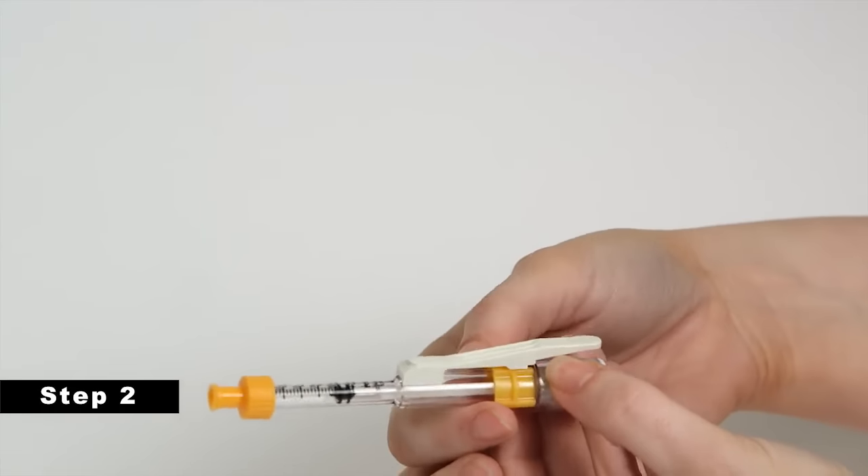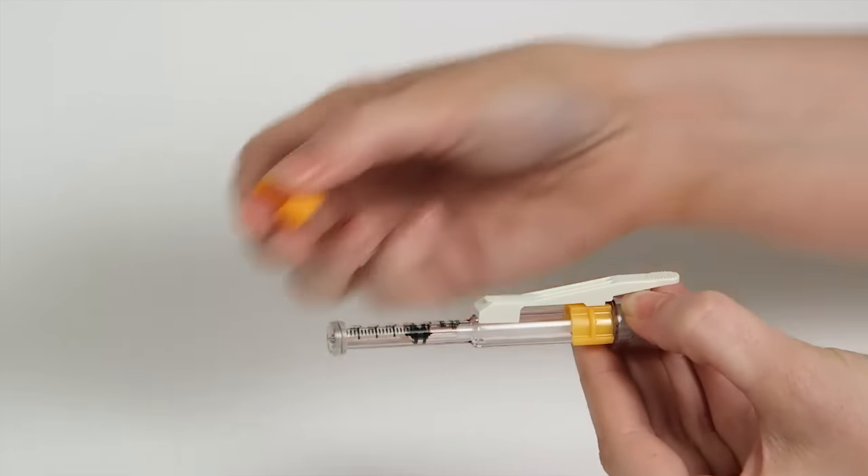Step 2. Prep the J-Tip for injection by removing the orange lure cap or sterility cap.